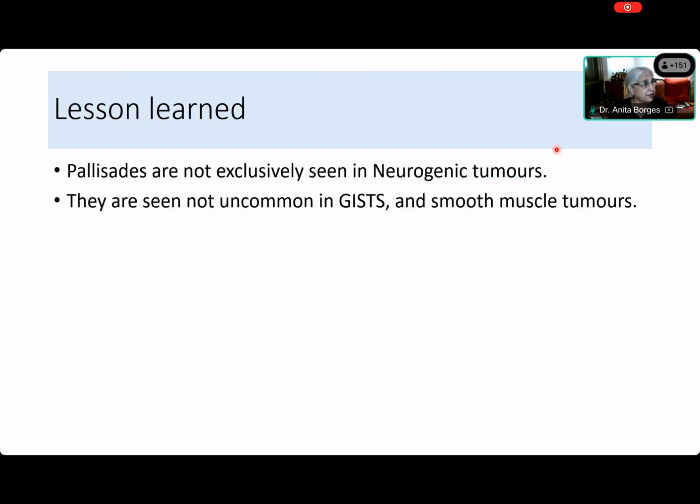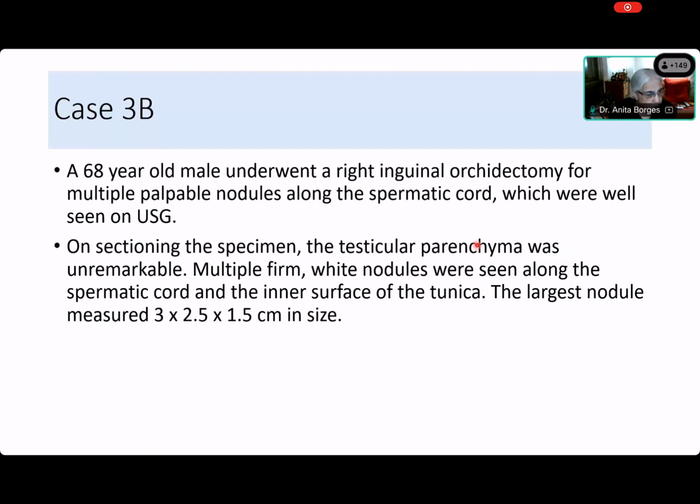So what is the lesson that we learned, Diksha? We learned that palisades are not exclusively seen in neurogenic tumors. They are seen not uncommonly in GISTs and in smooth muscle tumors. Okay, very good. All right, now who's going to do the next one? Any questions that I can answer?